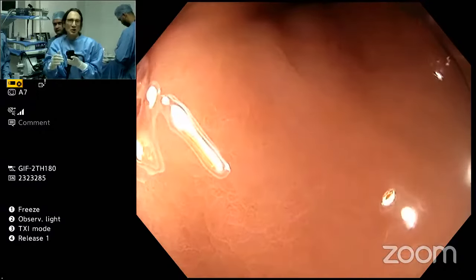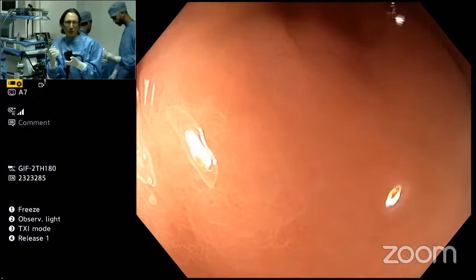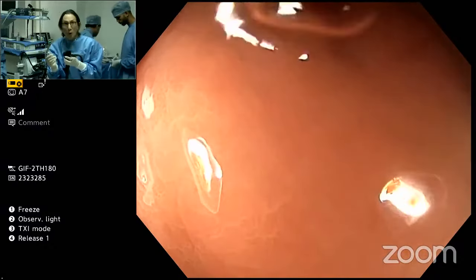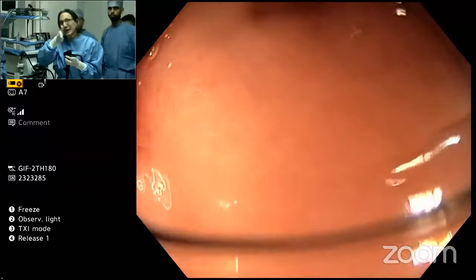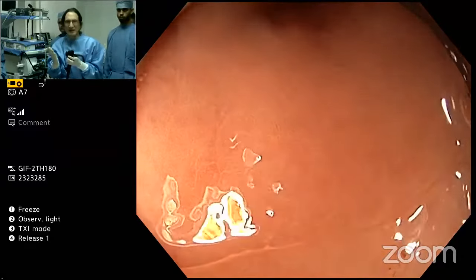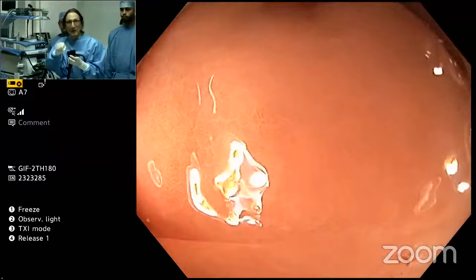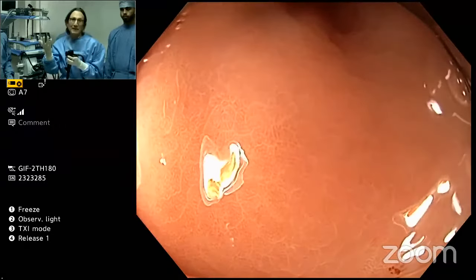You need to open the mucosa up, right, so that the underlying capsule can just enucleate. Or you can just go above the loop and cut it, or ESD it. There are different ways to do it. You could put a snare right above it and cut it, that'd be very fast. Or what'd be very easy is just use an ESD knife, a dissecting knife, and dissect above the loop. That'd be the other way to do it.